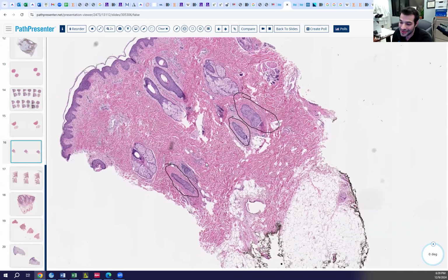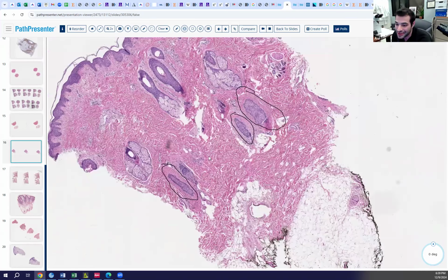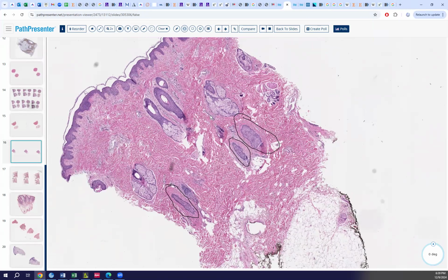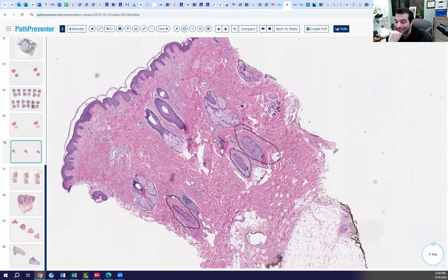But in this case, there's a pretty big telogen shift. Well, what's your diagnosis? Telogen effluvium. Ah, that's the trick question. And that will be on your boards. They love asking this, and telogen effluvium is an option, and it's the wrong option. Ruthless. Yeah, I know.